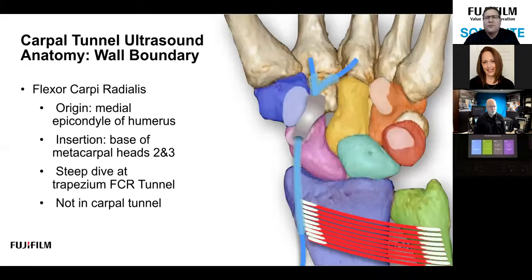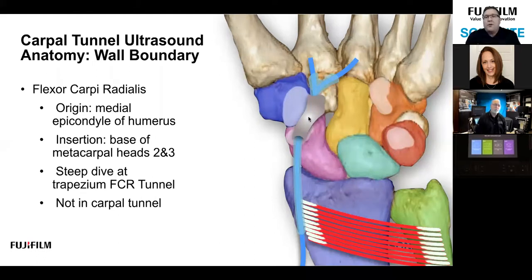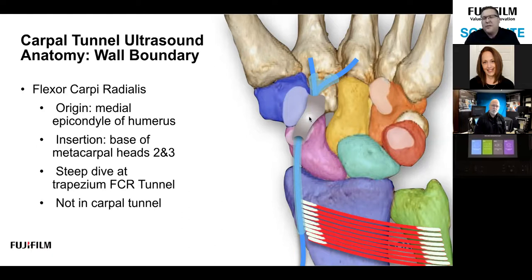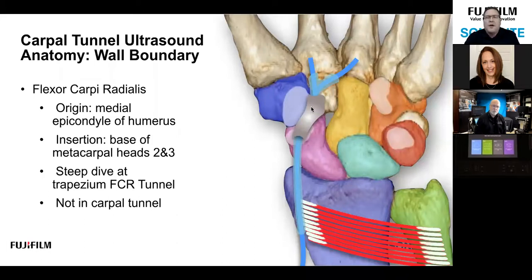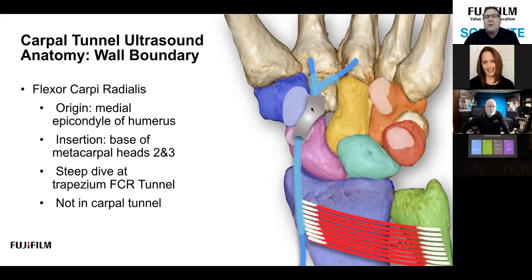Also traveling through the contents of the carpal tunnel, but not a part of the carpal tunnel itself, is the flexor carpi radialis (FCR). It travels over the scaphoid and at the trapezium tubercle you can see it resting in a little tunnel — the FCR tunnel — which has its own retinaculum and is external to the carpal tunnel. Be aware: if your transducer is angulated too distally or proximally, the FCR tunnel may look like a cyst. Don't call that a fluid collection — it is not a ganglion cyst.